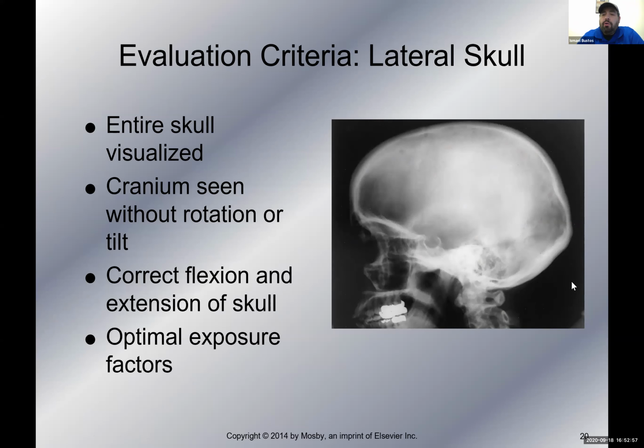And so there are parts of the anatomy on the skull that we can look at in order to determine if we have rotation or tilt, right? So first thing for what you need to know for rotation is you're going to see anterior posterior separation, which means if I have my items like this, they should be superimposed. But if I have anterior or posterior separation, then that means I had rotation, okay? Which means that my skull was sitting like this, right?